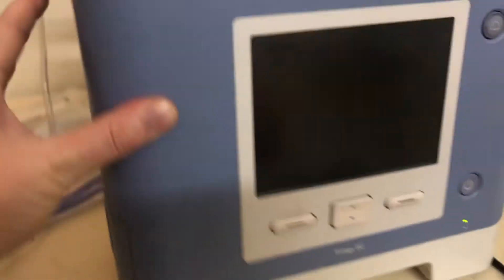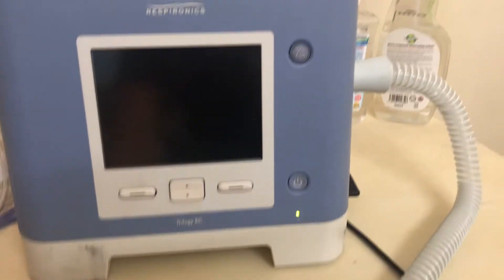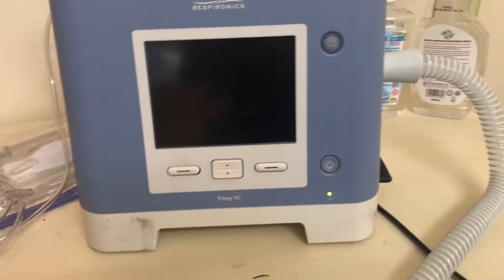Depending on how fast the patient is breathing and how much volume they're taking, you can get FiO2s of maybe 50 or 60. For a pediatric patient, probably a little bit higher.